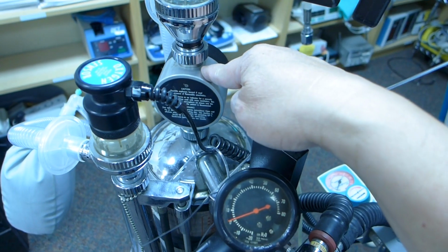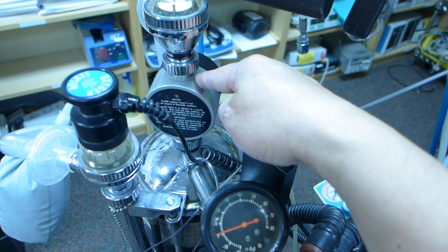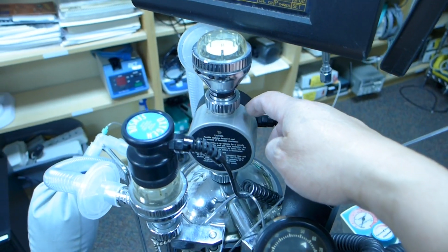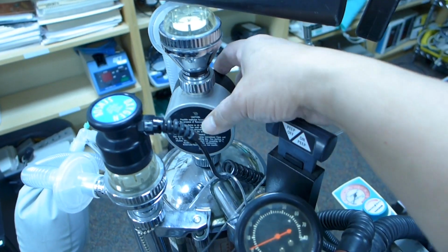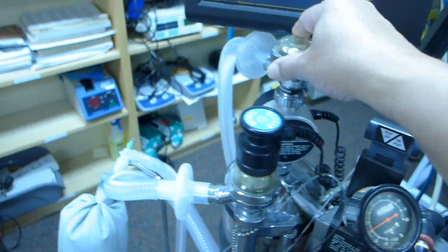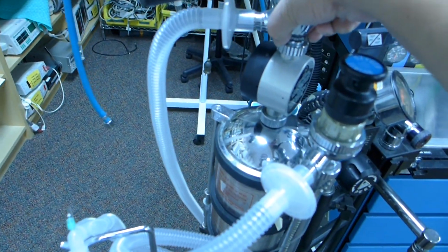The flow meters, or spirometers, sit under the expiratory valve of the anesthesia machine.